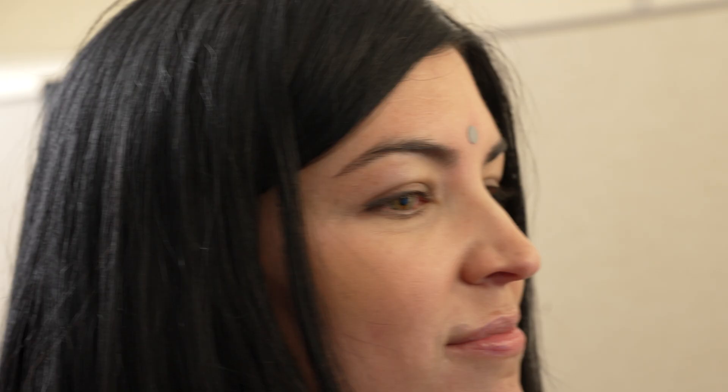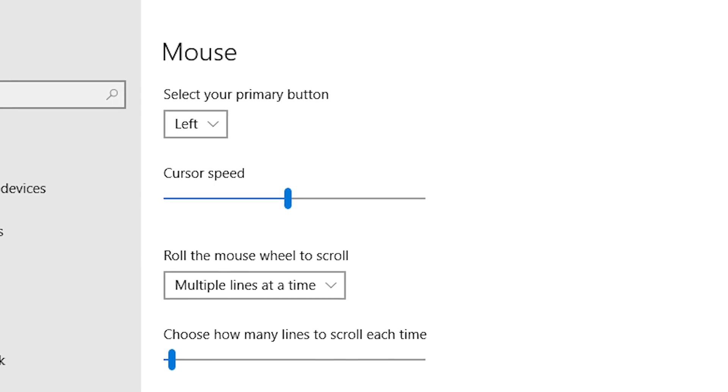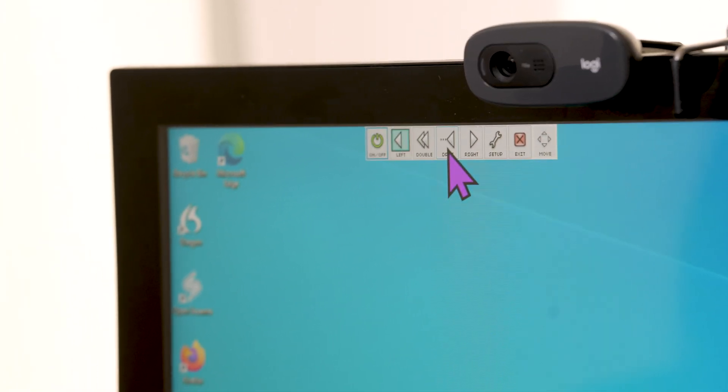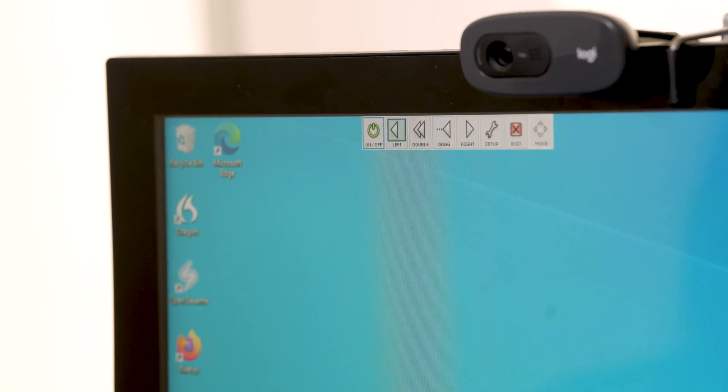So if you want it to be a little bit easier to move — if you have a little bit less head movement maybe — you would make the cursor speed faster, so it's more responsive. With this mouse, you would also use a dwell clicker to select an item. So you would hover over the dwell clicker on the screen to choose what you want to click: left click, double click, drag, or right, and then you would hover over the item you want to select.